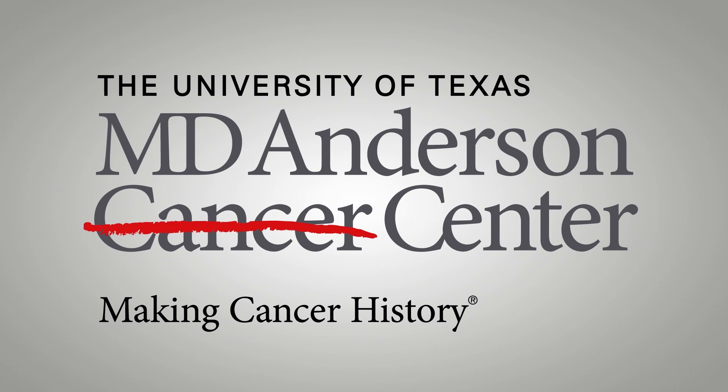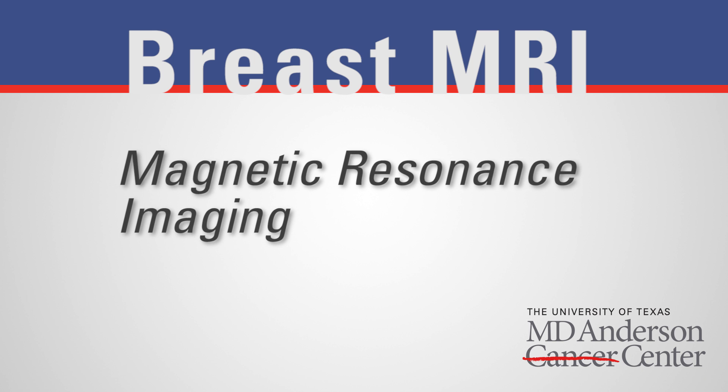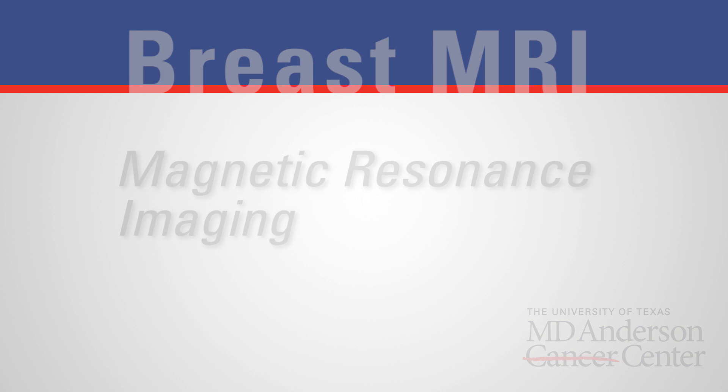Welcome to the MRI Department of Diagnostic Imaging. This is where you'll receive your breast MRI scan. The information in this video will help you prepare for your scan.